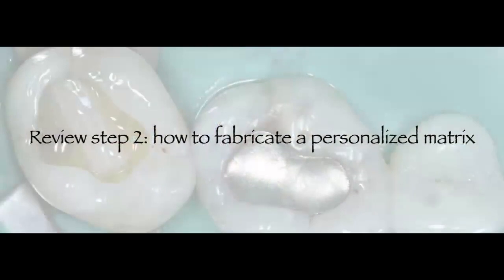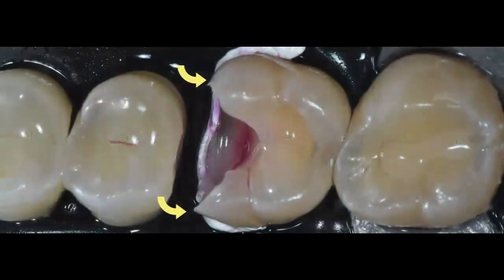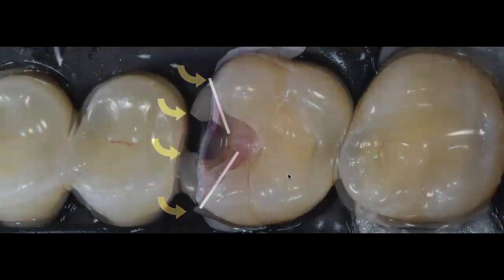So how do we fabricate? This comes now to the review of step number 2. How do I fabricate a personalized matrix? So now you know which would be the ideal case, and this is the ideal case for a personalized matrix band. And when and how do I do it?